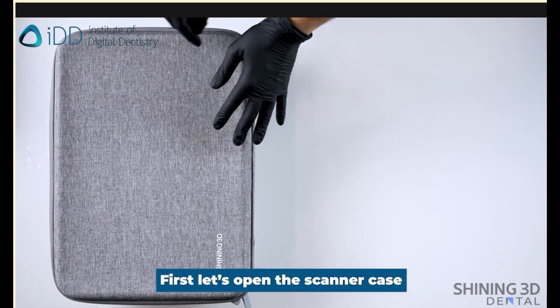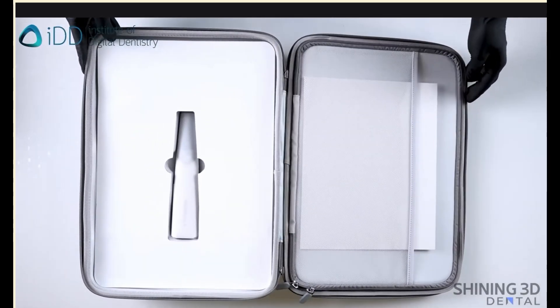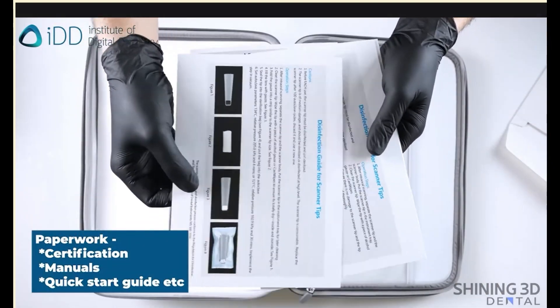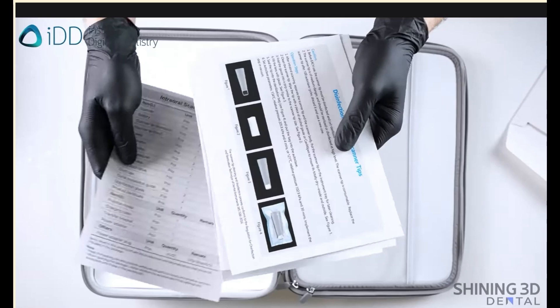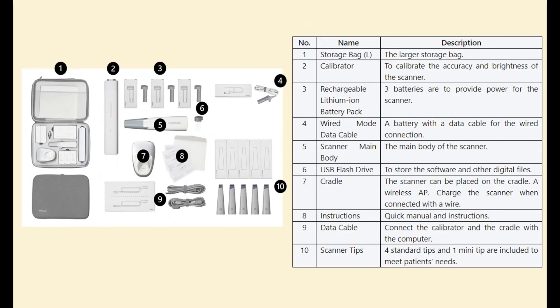The first thing to explore are the assembly and basic utility instructions. Most importantly, these documents include content lists and a sterilization guide for the scanner tips. You might want to laminate the sterilization guides, because the scanner tips are consumable and Shining claims that you can autoclave them up to a hundred times before replacing. And this is the content list.